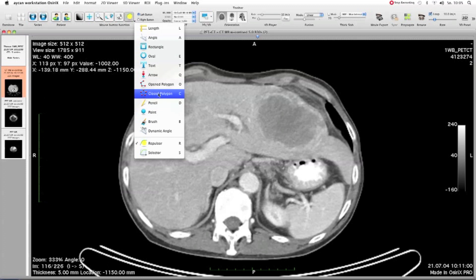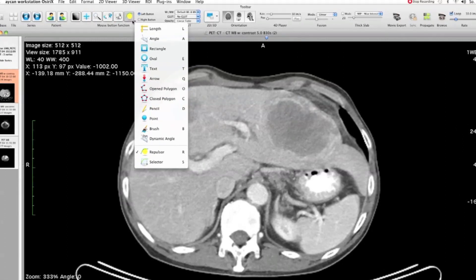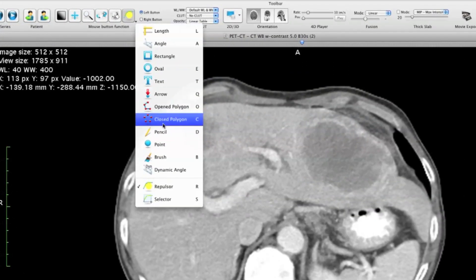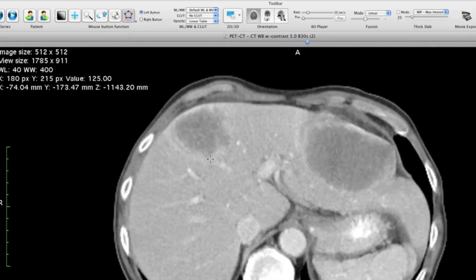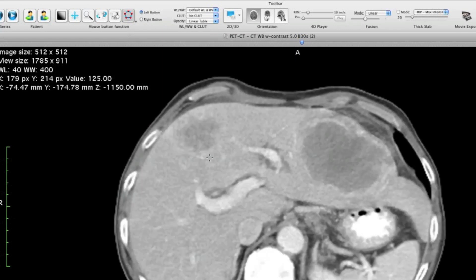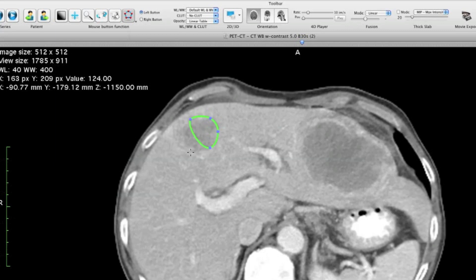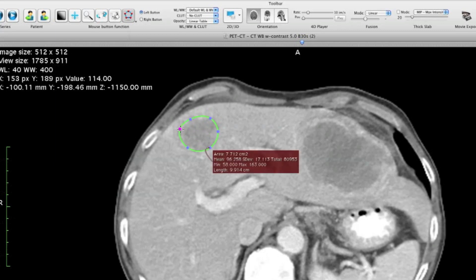Select the closed polygon tool from the ROI toolbar. Go to the beginning of the lesion and make several clicks to outline it. The last click should be a double-click, and the polygon will close.